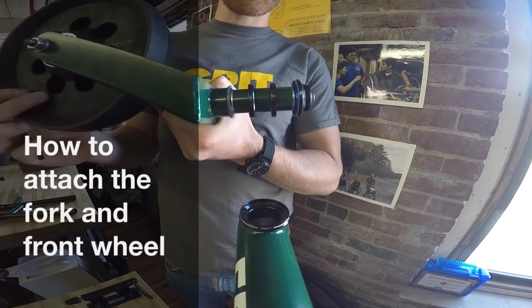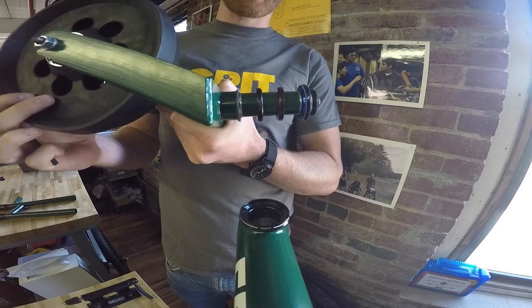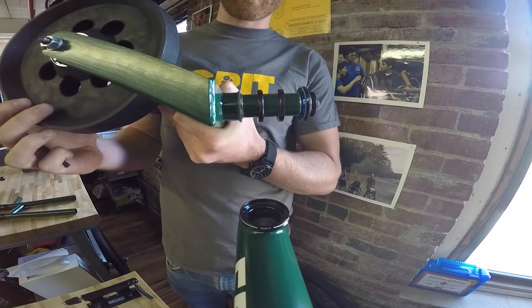Hi everyone. I just wanted to introduce how your Freedom Chair will be shipped to you — the fork will be removed. So there's a little bit of assembly required, and we're going to walk you through how to do that right now.